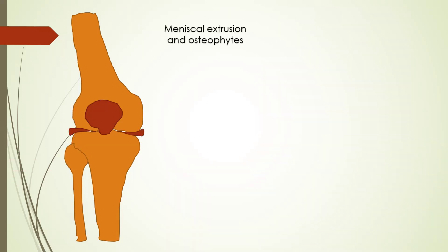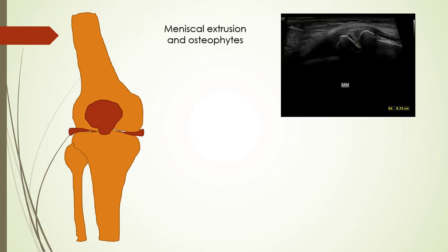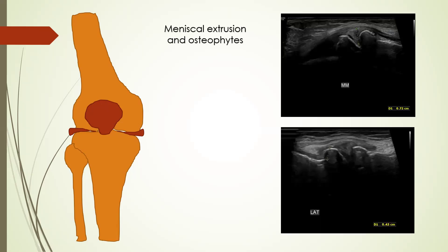Next is meniscal extrusion and osteophytes, which are indicators of degenerative joint disease or osteoarthritis, which very commonly affects the knee joint. We can see large osteophytes along the articular surface and meniscal extrusion, which are indirect indicators of loss of joint space.